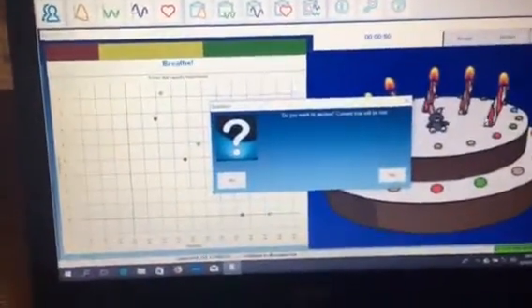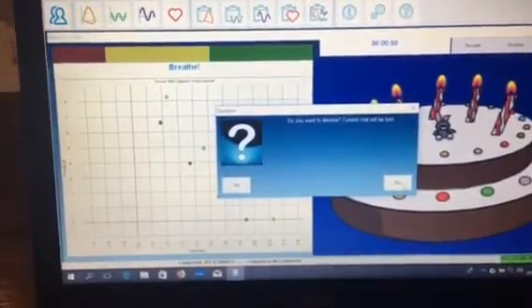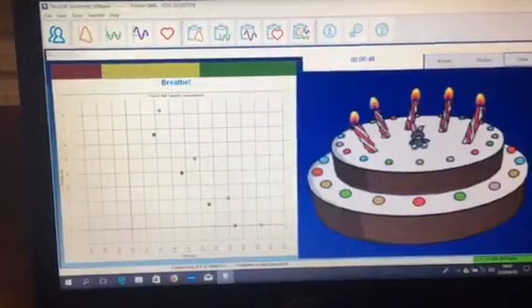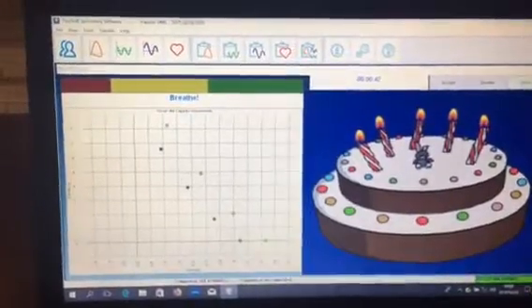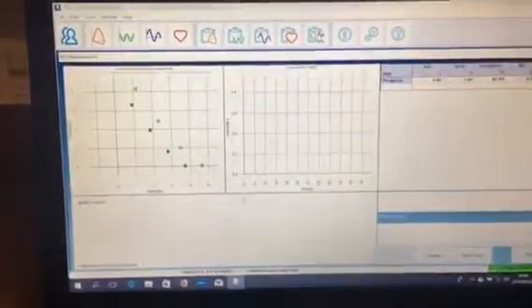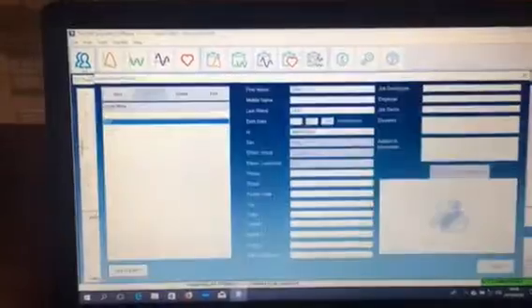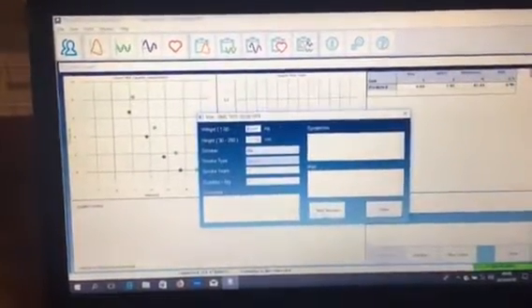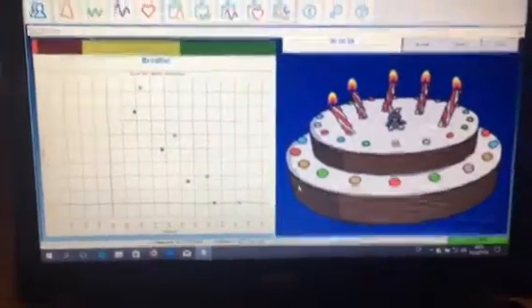Now, moving back to the test. Please start force expiration and inspiration test now.